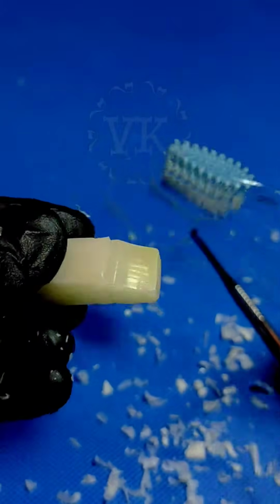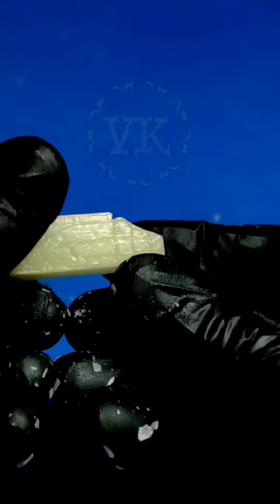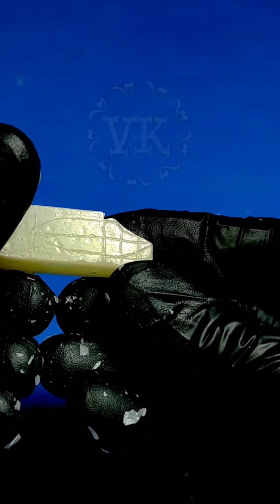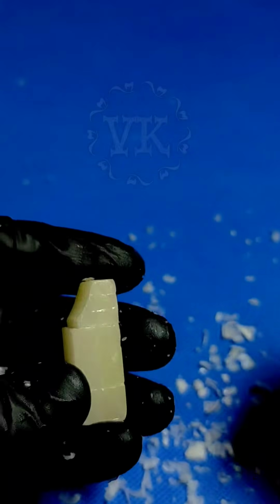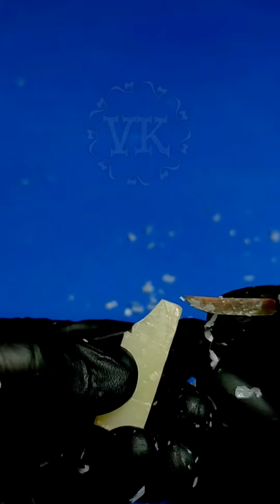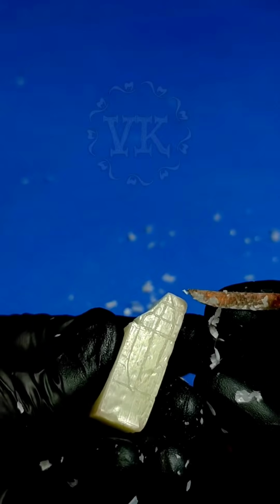Take a brush, clean off all the wax flakes. Now check the outline. Almost close, just a small bit of wax left behind. The idea is to keep the outline as perfect as possible, because we are already making something larger. So if you leave some wax outside the outline that you're making, your carving might become a bit bigger.